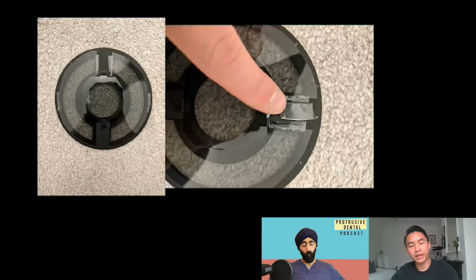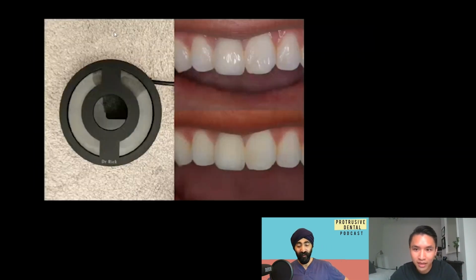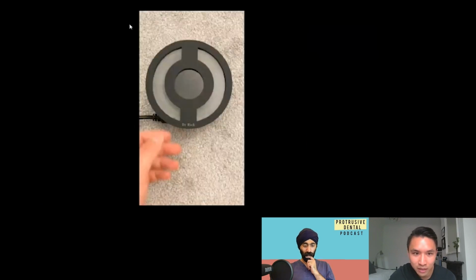So I've got a link to magnets. Wow, this is a serious operation from Amazon. I'm very impressed. And then just test it again. Make sure you're happy with it. So these are pictures I just took of my own teeth with my flash. Make sure it works, and then you can mount it.